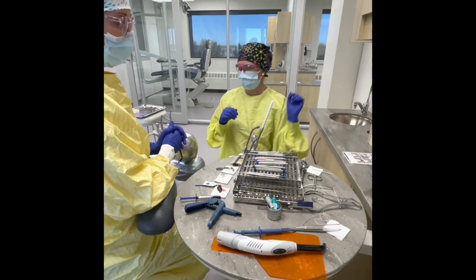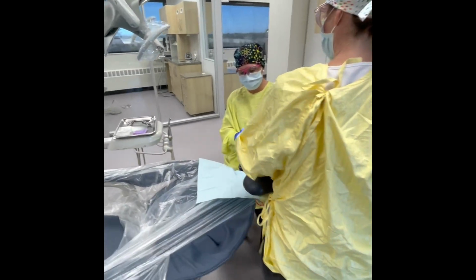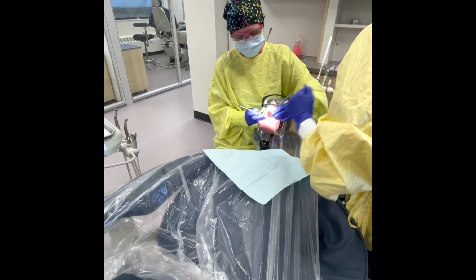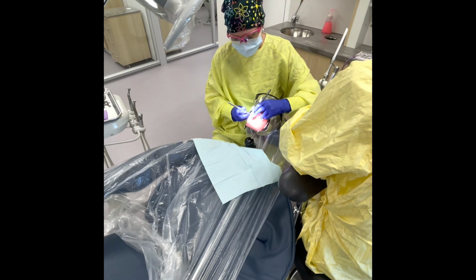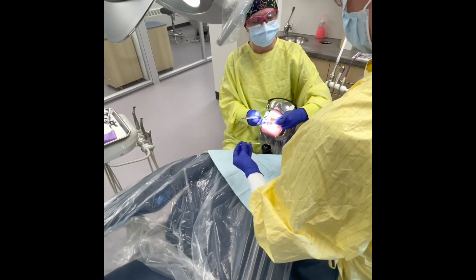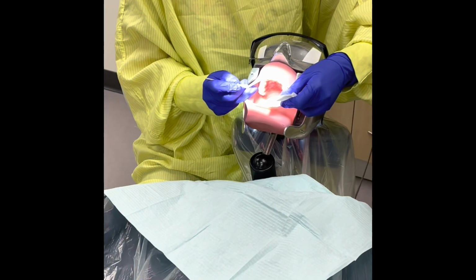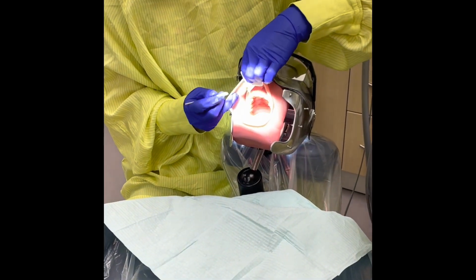Okay, so the first thing that your operator is going to do is request their mirror and explorer so they can check where the fillings are going to be done. Today we are working on this anterior tooth here, number 12, as well as number 16. Okay, perfect. Those cavities are still there, so we're ready to proceed. So Stacey is going to two-hand pass the topical anesthetic. I will dry and place our topical anesthetic.